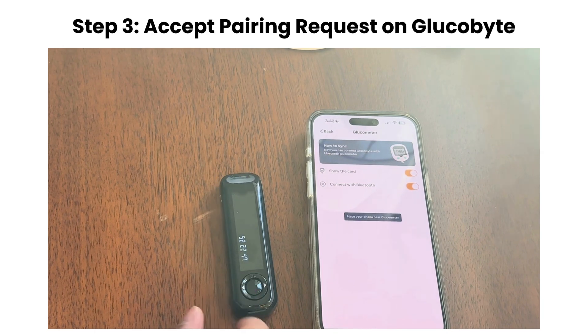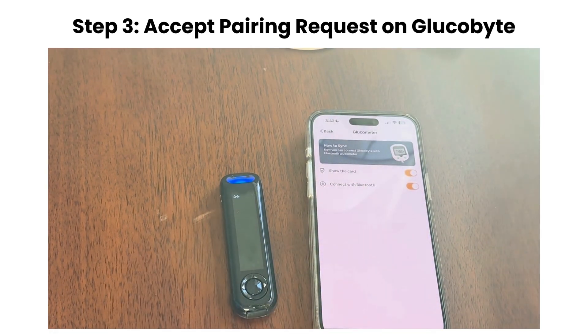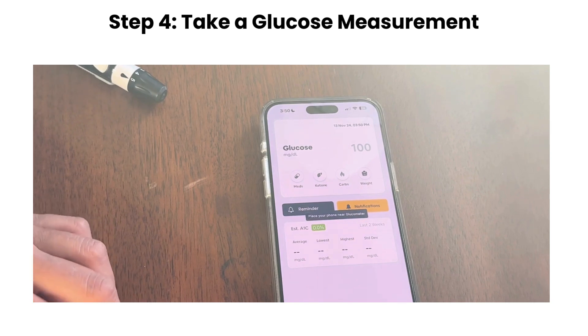On the Glucobyte app, you'll see a pairing request message. Tap OK, and once connected, you should see a success message on the device. Now take a glucose measurement, and the data will automatically transfer to Glucobyte, logging your result in the app seamlessly.